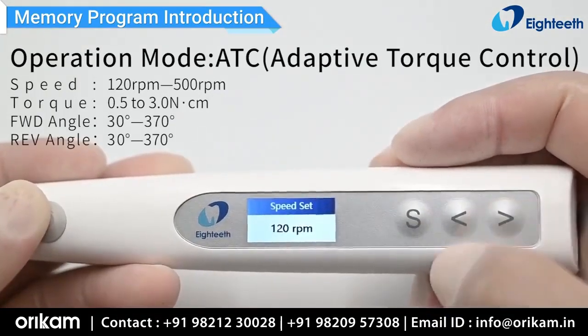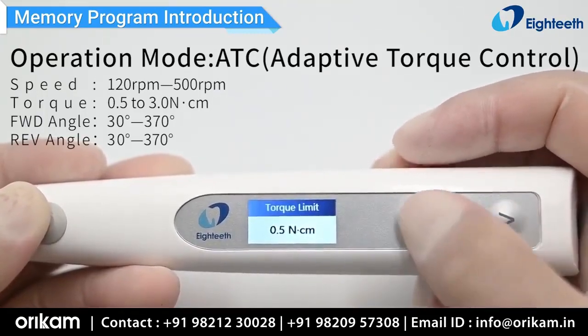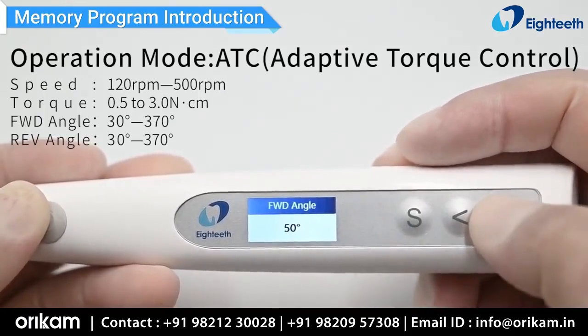ATC means that after reaching the preset torque, the file will reciprocate. When the torque is released, the file will keep rotating. The reciprocating angle is adjustable.